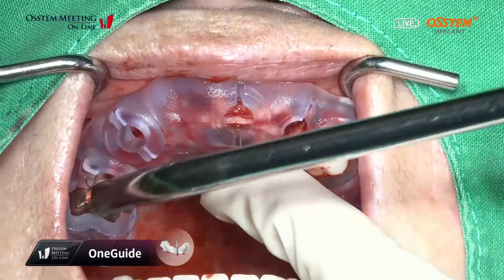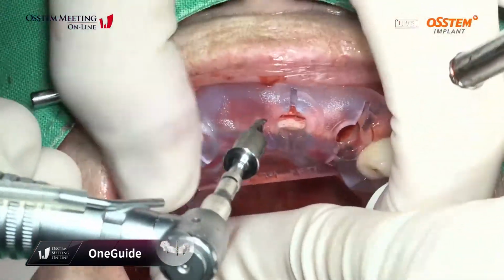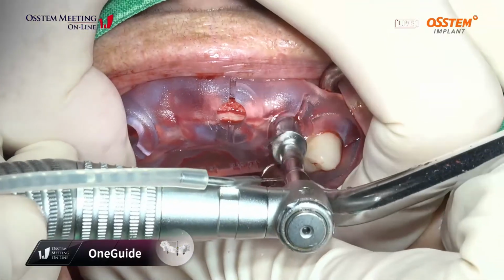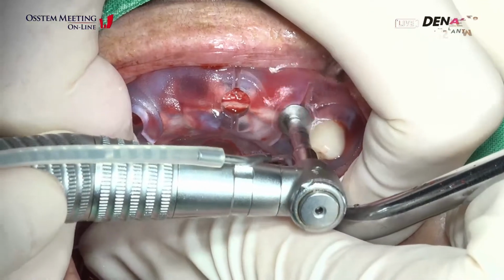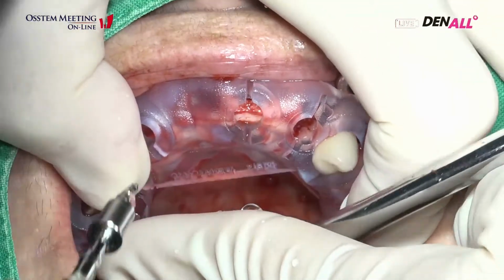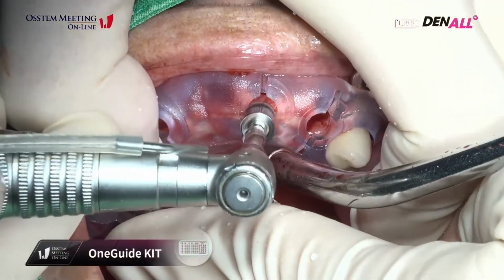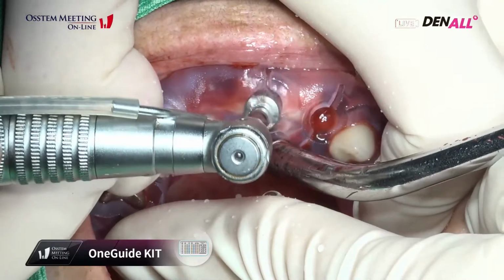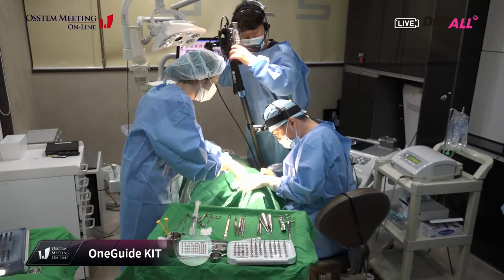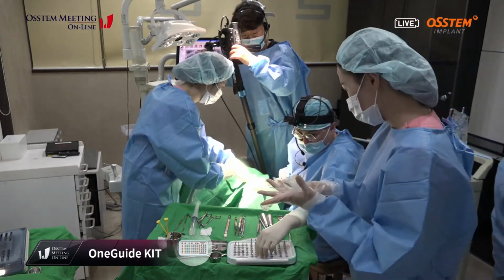So initial drilling. Yeah, canine. So I will use flattening drill first.